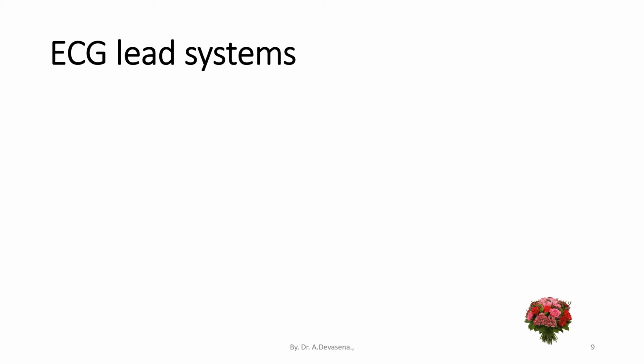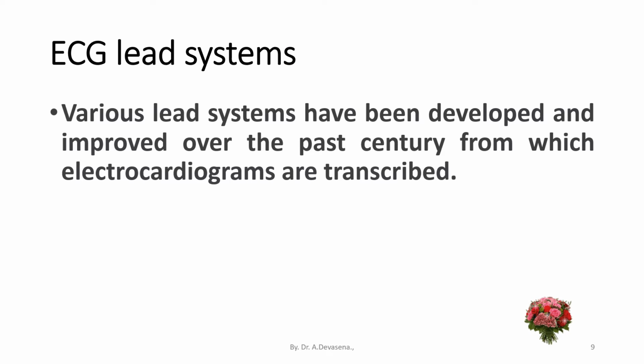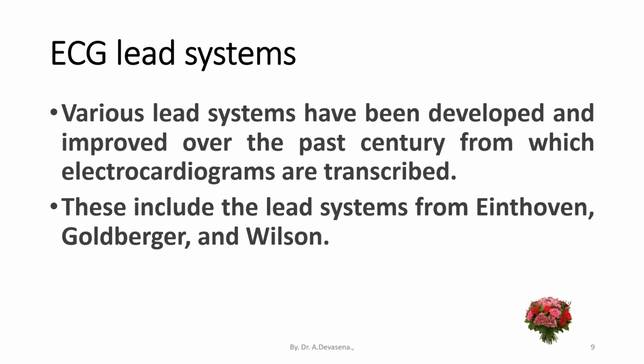ECG lead systems. Various lead systems have been developed and improved over the past century, from which electrocardiograms are transcribed. These include the lead systems from Einthoven, Goldberger, and Wilson.